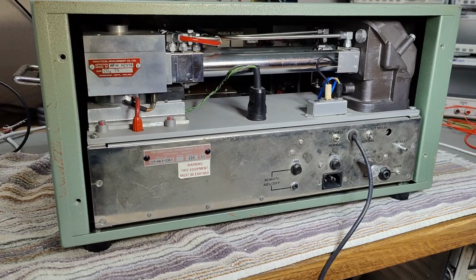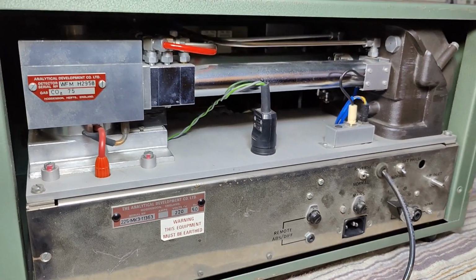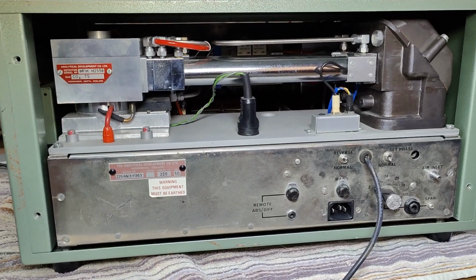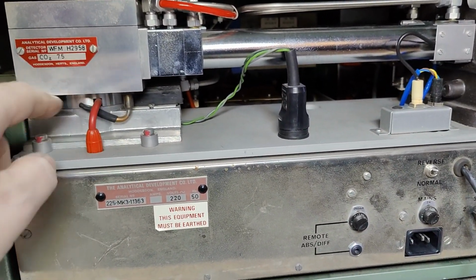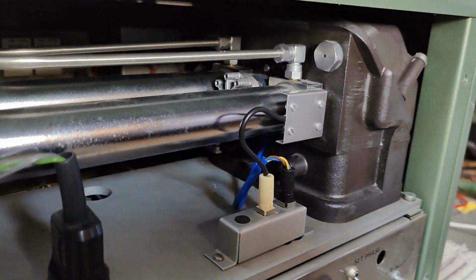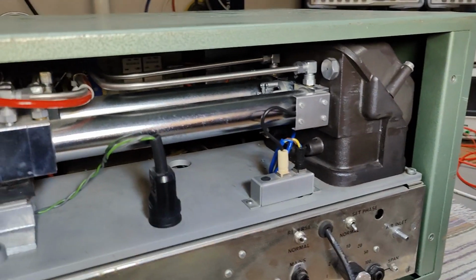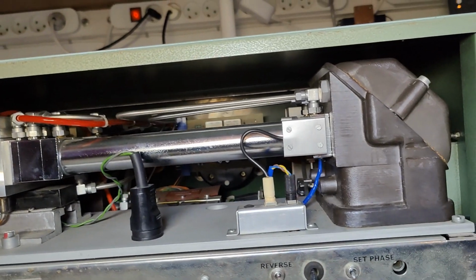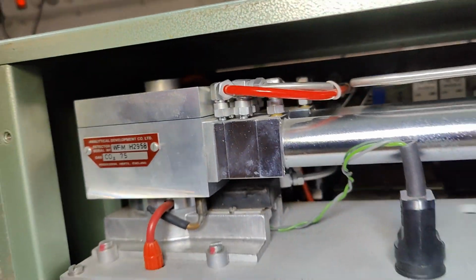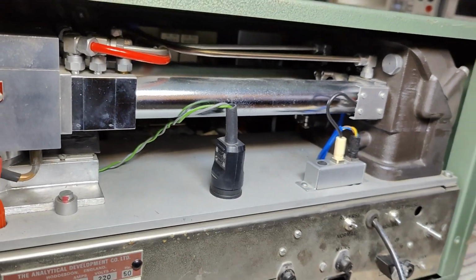I just had one of my little yelling and screaming moments. What the heck is going on here, man? This unit looks absolutely interesting. All sorts of, what is that? Some vacuum and pumps and all sorts of sexy stuff going on here. And that is probably a little pump. Yeah, that is a motor that can go around. And wow, that is interesting. Can't wait to have a deeper look at what is going on in here. But definitely a wow experience.